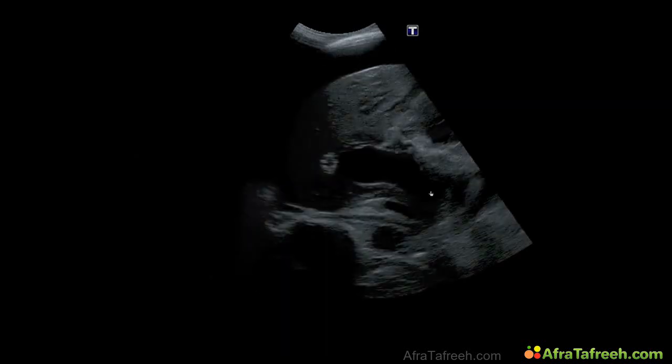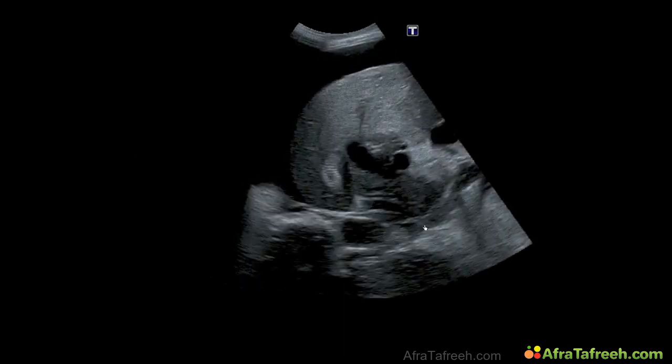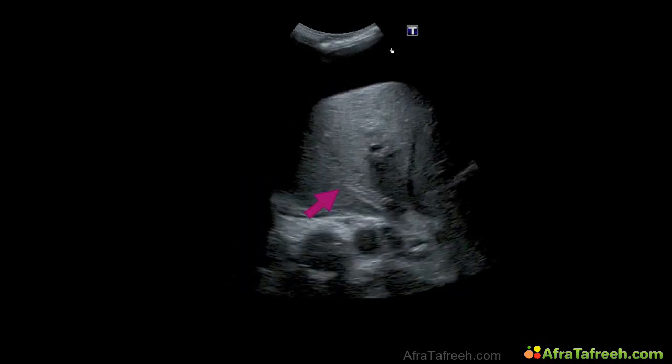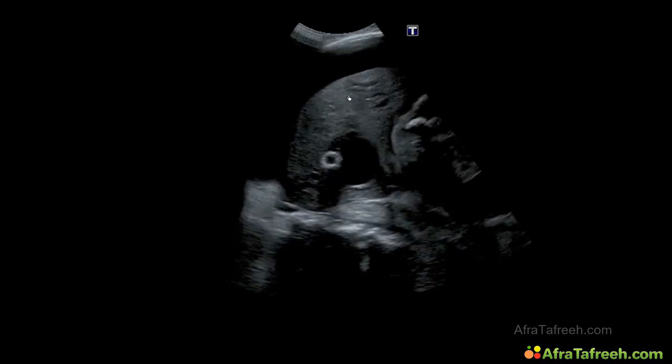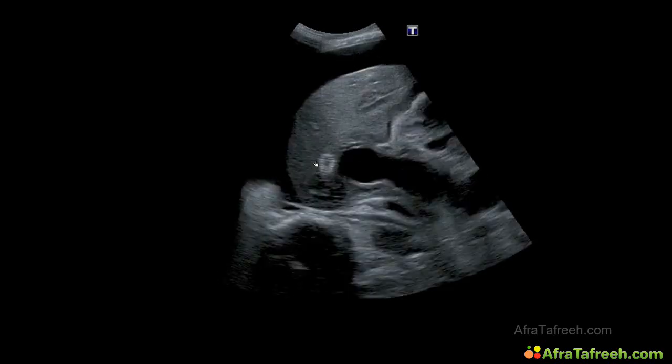We got a dilated portal vein. And in this vein, we got this structure over here, which is his TIPS. Again, we see the ascites, inhomogeneous texture, narrow liver vein, and the capsula is not so clearly seen over here. So let's recapitulate the ultrasound features of liver cirrhosis.